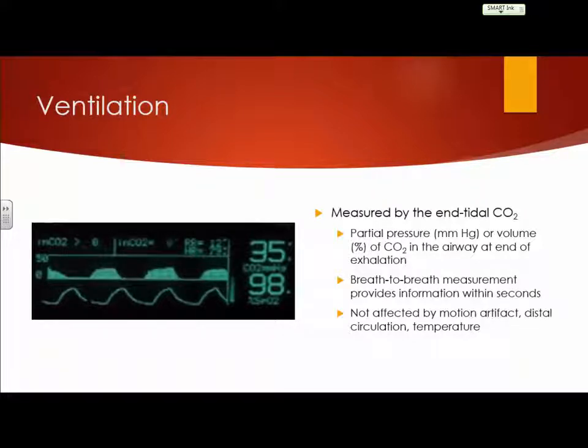Trying to figure out. I'll just tell you. Sometimes patients may have aspirated and you get crap up, or let's say you've intubated somebody with pulmonary edema and you're getting that junk up from the lungs, or somebody with pneumonia and you're getting that sputum up. What may happen is that junk clogs up your lines very easily.